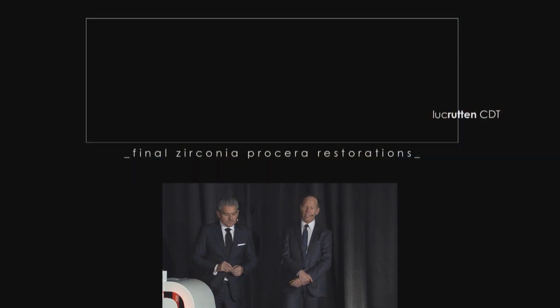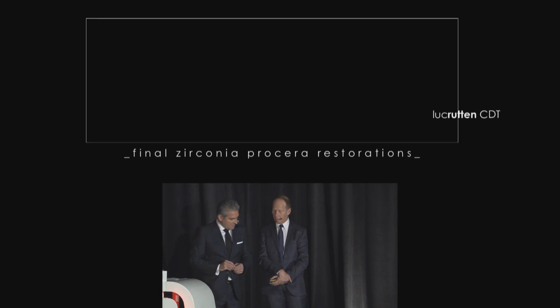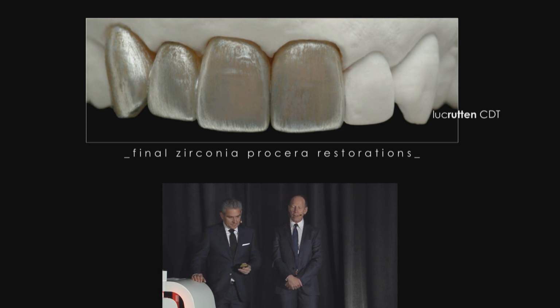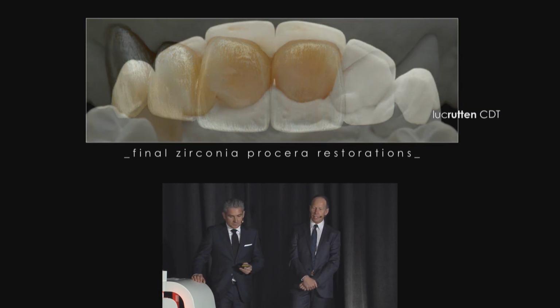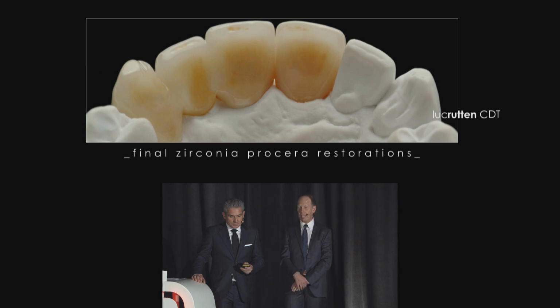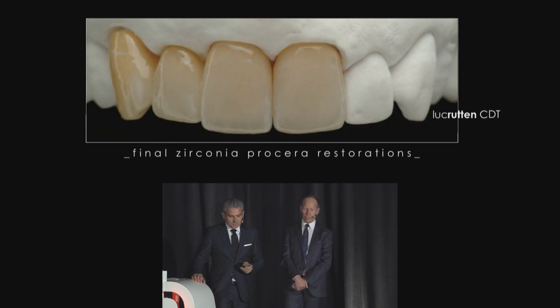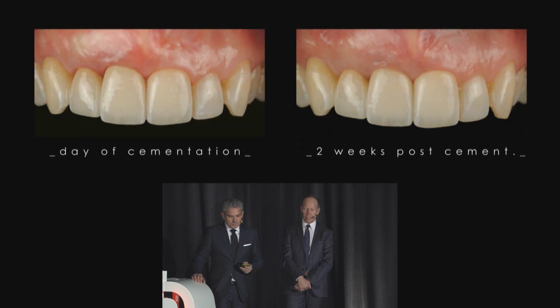And here you can see the final restoration. Sometimes we spray with silver powder to see the contour and the texture a little bit better. This is from the palatal side, and you can clearly see that the ovate pontic comes out just like a natural tooth out of the gingiva.